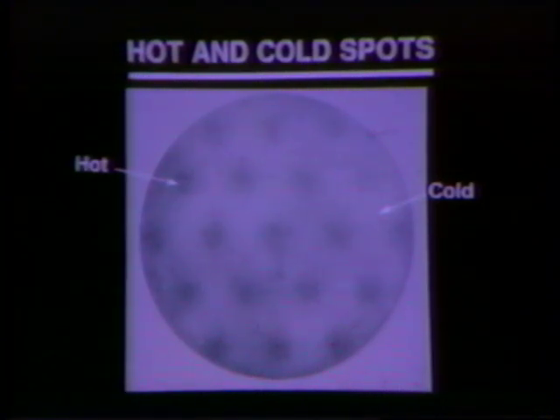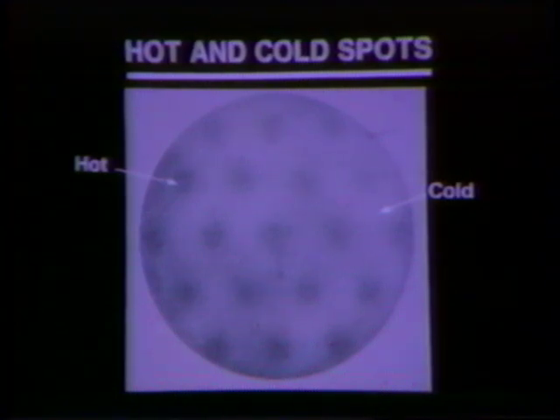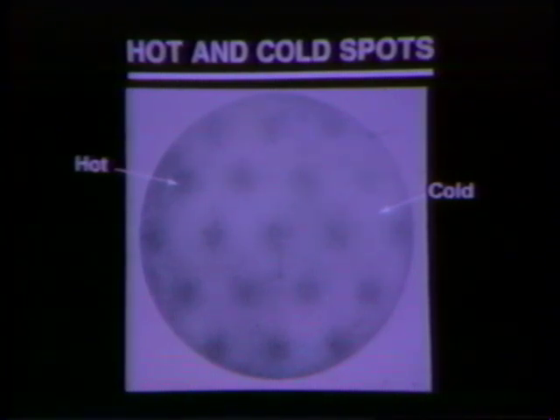Since we're not trying to image straight lines in the patient's body, these small nonlinearities will not affect the resolution of the camera system. They will, however, affect the uniformity of the system, because in areas of the detector where events are distorted, the system will see more events in areas where events are displaced toward the center of the tubes than it will in areas where the events are displaced away from or between the tubes. This will cause hot and cold spots in the image. For this reason, we would like some method of correcting these distortions so that all events can be recorded accurately.